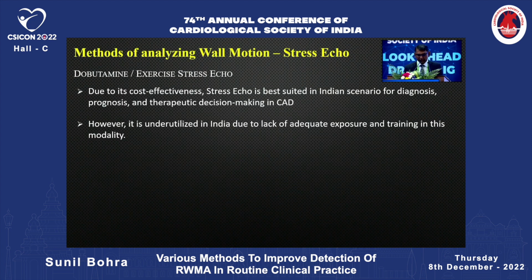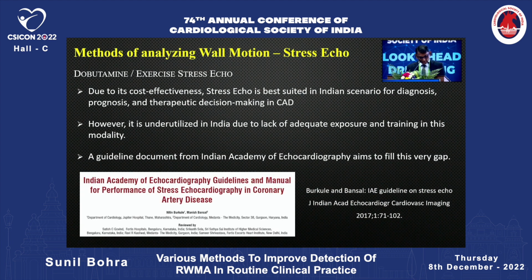So just a few more slides on stress echocardiography. Dobutamine stress echo is very useful. Due to its cost effectiveness, stress echo is best suited for the Indian scenario for diagnosis, prognosis and therapeutic decision making in coronary artery disease. However, it is underutilized in India. But I'm proud that the Indian Academy of Echocardiography has published its guidelines on this, and I would recommend all of you to go through this document, very well written, and all the details of my next slides are taken from that article.